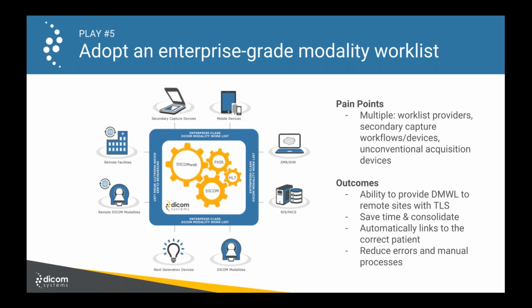Thank you so much. So let's talk about an enterprise-grade modality worklist. So again, worklist is not a new concept in enterprise imaging. It's been around for as long as there've been modalities communicating via digital means, via DICOM. So providing worklist is not necessarily a challenge. Providing worklist on a massive scale to potentially thousands of modalities across a complex network, that could be problematic.